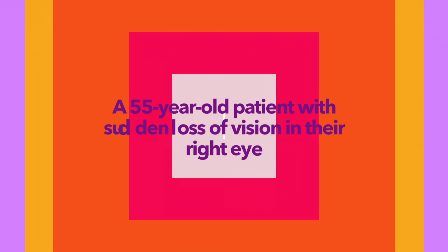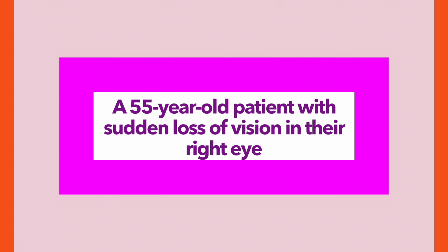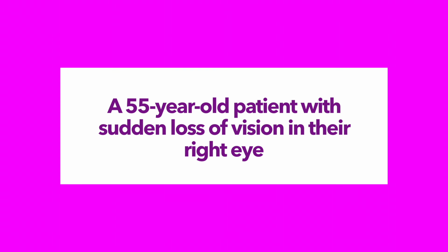In this video, I'm presenting to you a case of a 55-year-old patient with sudden loss of vision in their right eye. There's no RAPD, and here's the case.